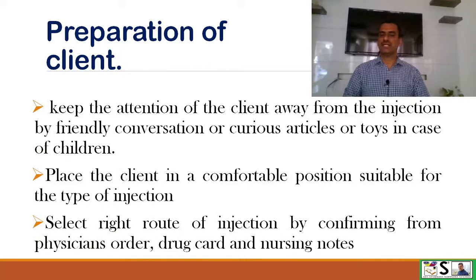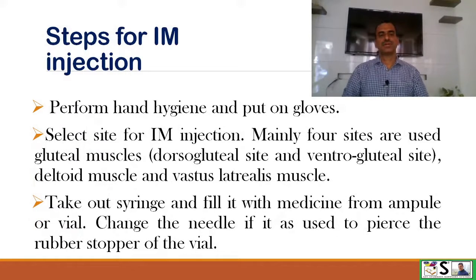Keep attention of the client away from the medication by friendly conversation or curious articles or toys in case of giving injection to children. Place the client in a comfortable position suitable for the type of injection we are giving. Select the right route for injection by confirming the physician's order, medication card and nursing notes. Perform hand hygiene, then put on gloves.